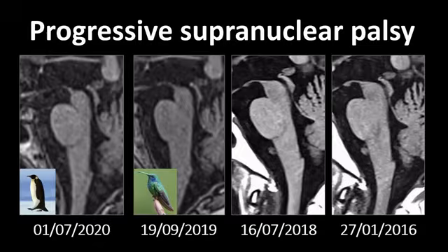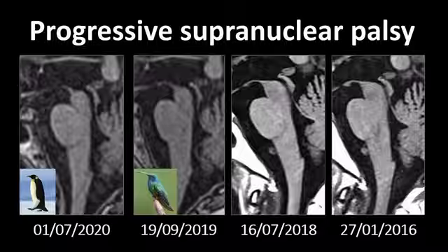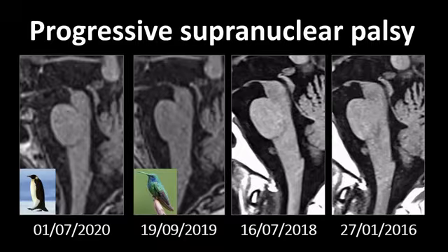So in my experience, the day a radiology resident in training learns about a hummingbird sign is also the day he starts seeing them and reporting them. So you really have to tone down their enthusiasm a bit, and say, well, you can't always recognize it. So when is it truly a penguin sign or a hummingbird sign?